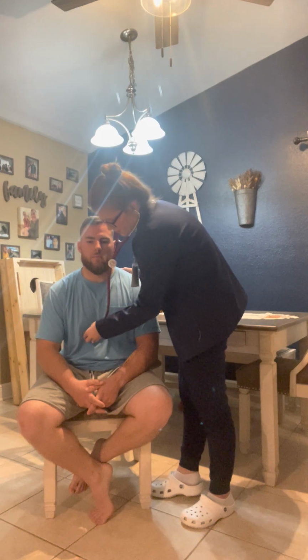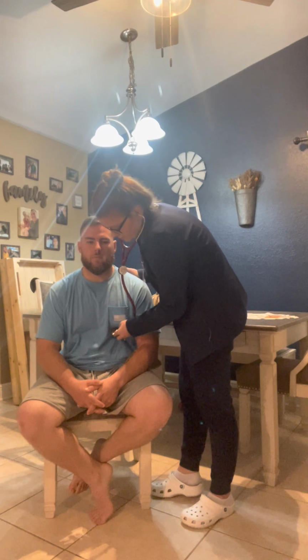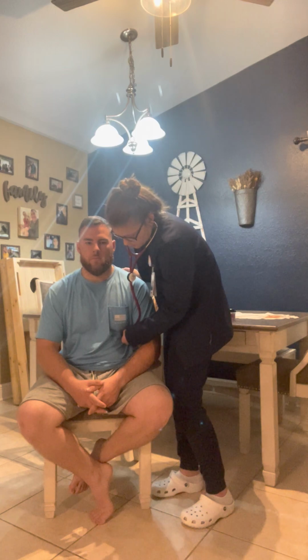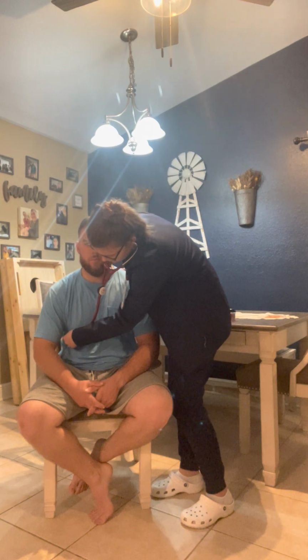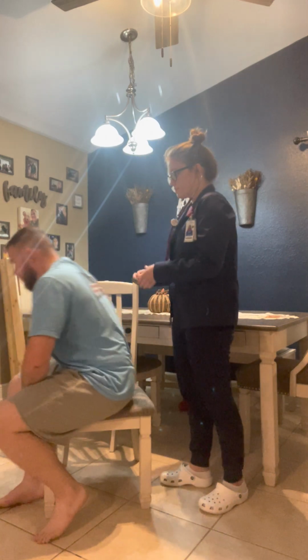We're down into the vesicular sounds now. I want to make sure I'm getting the right 3 lobes and the left 2 lobes. And you want to make sure you listen all the way over on the axillary side, so you're reaching all parts of the lobes. I don't hear any adventitious sounds. They sound clear at this point. I'm going to have him turn again. We're going to listen to the same spots on the back.